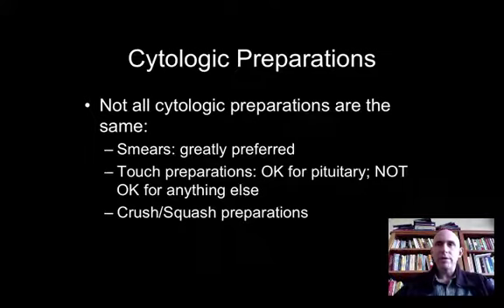Pituitaries and pituitary adenoma touches like a dream. It's really a nice way to look at the material. That said, if it's not pituitary adenoma that you're dealing with, then, for instance, if it's a pituicytoma or some rare tumor within the sella, really the touch preparations are worthless. So I greatly prefer smear preparations even for sellar lesions.